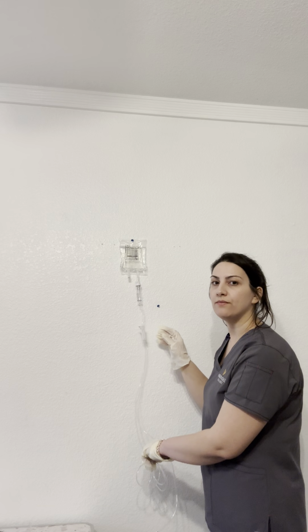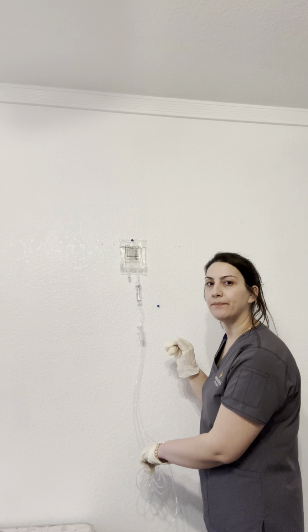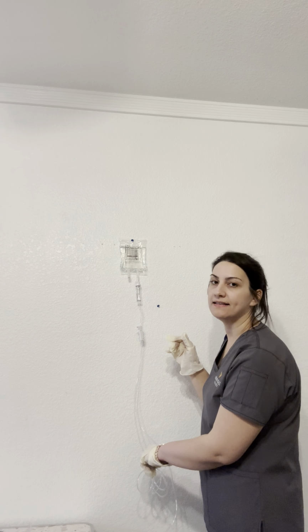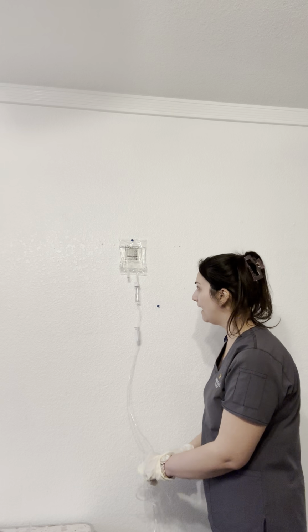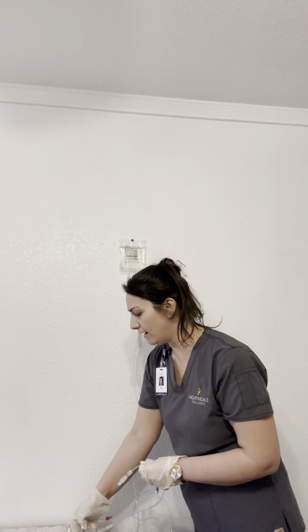Also, we want to make sure that we hang the IV bag 30 inches above the patient's IV site. Next, we're going to connect the secondary tubing right here.